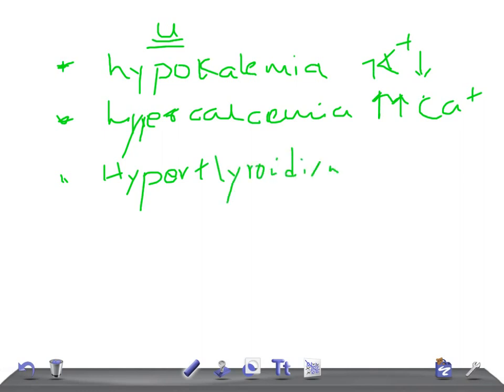If you see prominent U-waves, think of hypokalemia, hypercalcemia, or hyperthyroidism. Look at other EKG findings of hypokalemia like small T-waves, depression of ST segment, and first-degree AV atrioventricular block. Check the blood potassium level and treat accordingly.